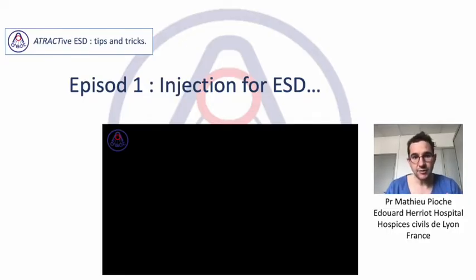Some of them can also be used for EMR, but mainly here we will discuss the strategy for ESD, and therefore all the tricks that help your ESD to be safer, faster, more effective, and therefore more attractive.